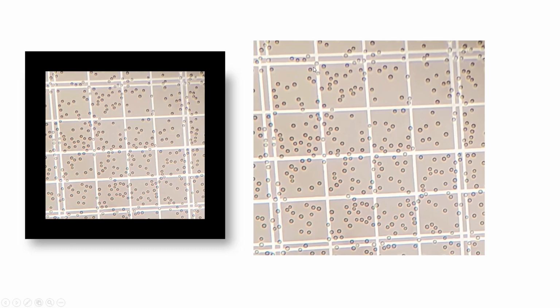So let's take a look at how we can count. Here's a blown up area, and I'm going to show you how to count this upper left sub box. I'm going to use little X's to denote that I've counted a cell. So I've counted this one, then this one, and so on, one after another through the whole sub box.